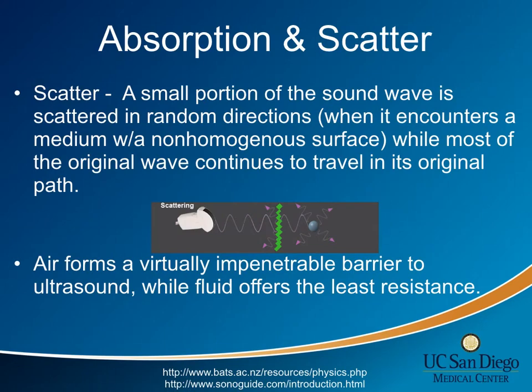Scatter occurs when the sound waves encounter a medium with a non-homogeneous surface, causing a portion of it to scatter in random directions. This is particularly obvious when imaging the pleura or bowel, as they are typically filled with air.